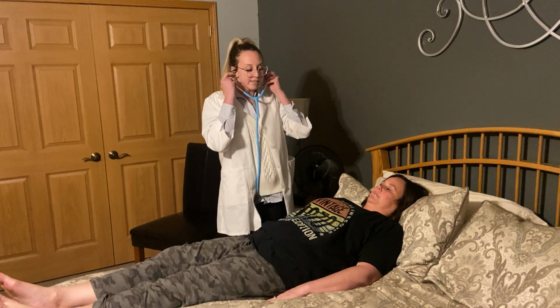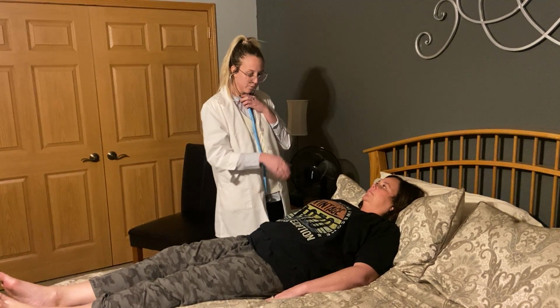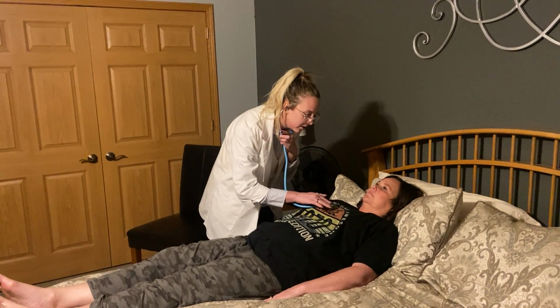Next, I'm going to listen. So Rhonda, you're just going to breathe normally, and I'm going to move my stethoscope across your chest, listening for any abnormal heart sounds, and I'm going to start with the diaphragm of my stethoscope.